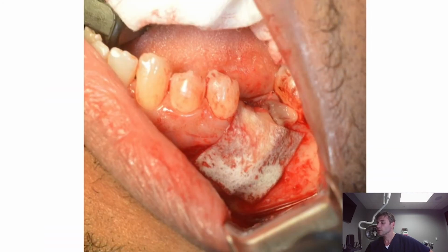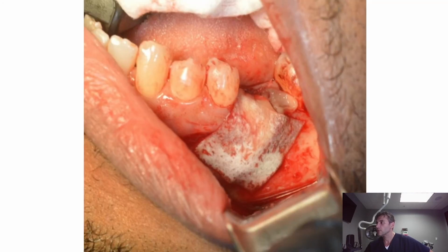And this is what the membrane looks like. This is cross-linked collagen. This is the membrane. And this is what you call guided bone regeneration. The reason why we put this membrane is we use it as a barrier, so the soft tissue cells, the cells from the tissue that are here, won't grow into the graft. So this acts like a barrier.